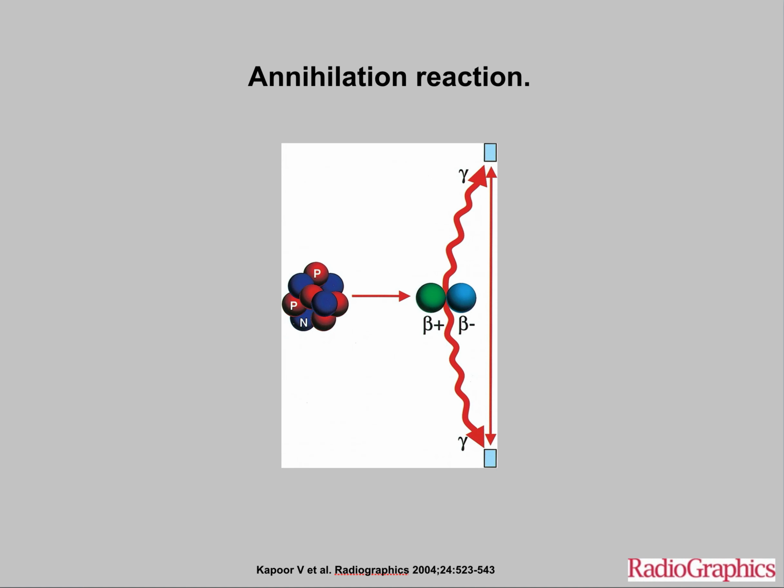The basis for PET imaging is the F18 emitting a positron as it decays to oxygen, and that positron, upon hitting an electron, emits a pair of 511 keV gamma rays that will be hitting detectors at the same time. So PET relies on coincidence detection, meaning detectors on the opposite side of the gantry are triggered, so we're able to draw a line in between, not just a point as with the gamma camera.